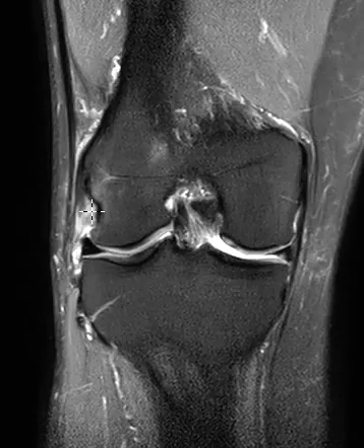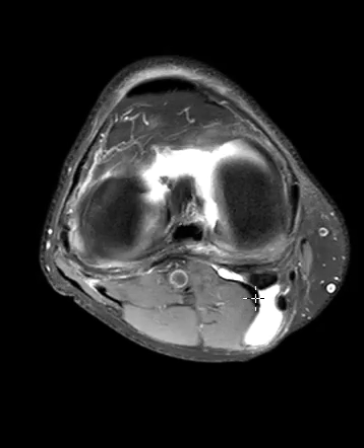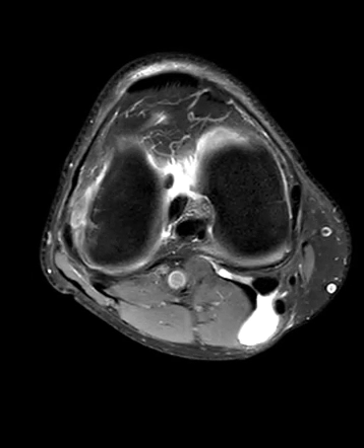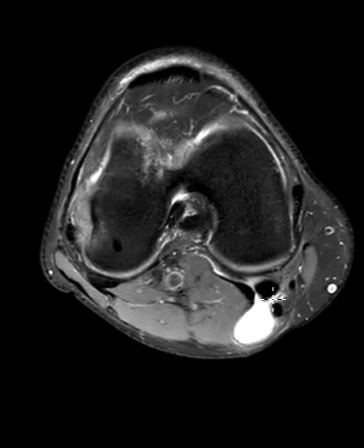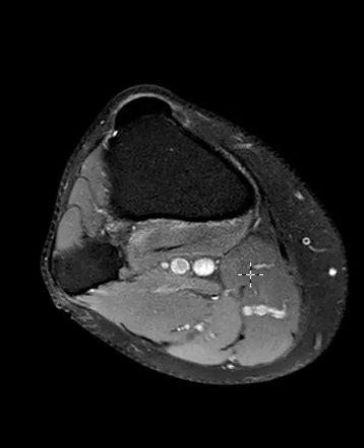So now we're going to put up the axial images to try to find that. On the axial images, this is the medial side here, and we can see a popliteal cyst here. Now we're going to look for the popliteus muscle.